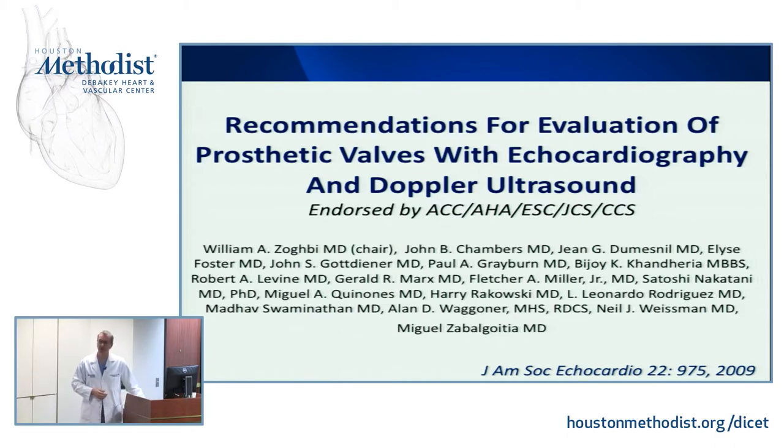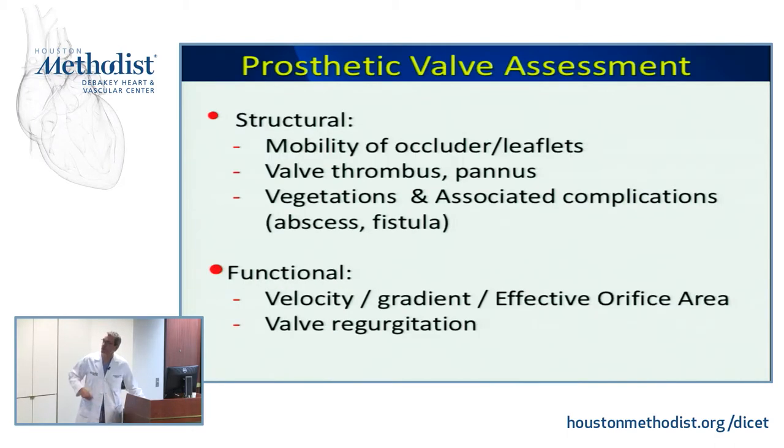All right, so the basic approach, no matter what the valve, is to think broadly. There's structural issues and there's functional issues. And often they interrelate, but not always. Sometimes there's just a structural problem, and the function, as far as we can tell, is okay. And sometimes the function is abnormal when structurally we don't see what the problem is. So it is important to think about every valve with this very simple approach.